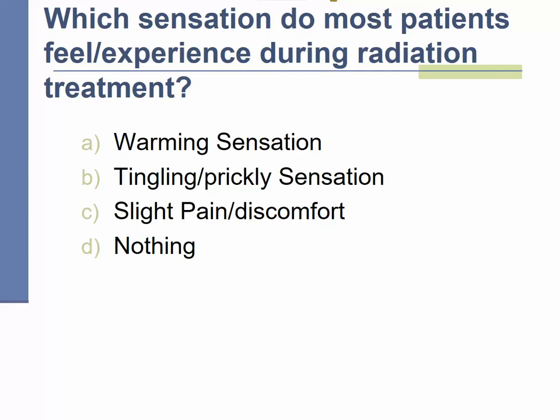Okay, so what do patients actually feel when the beam's turned on and they're receiving their treatment? So I'll just get you to look at these quick examples here and see which answer you would pick. If you pick D, you are correct. They actually don't feel anything at all. What patients mostly experience while they're laying on the treatment couch is, they can hear the machine moving around them, and they can hear some of the electronics in the head of the machine moving during their treatment as well. But as far as what they actually feel themselves, it's nothing at all.